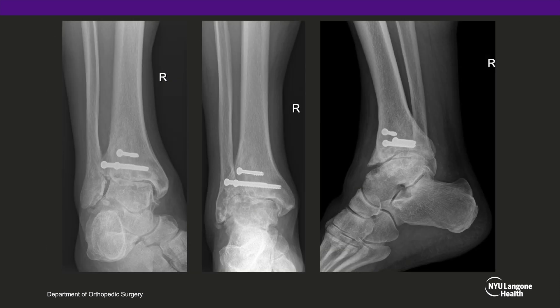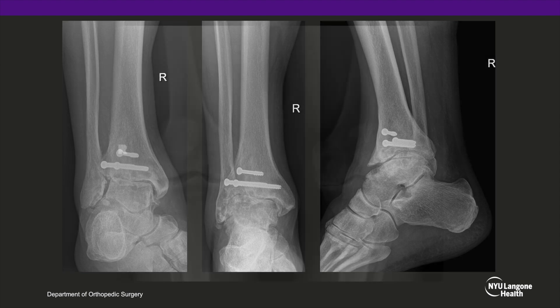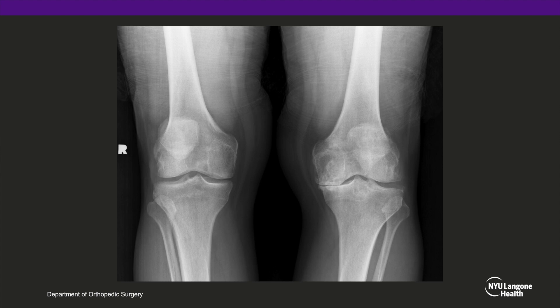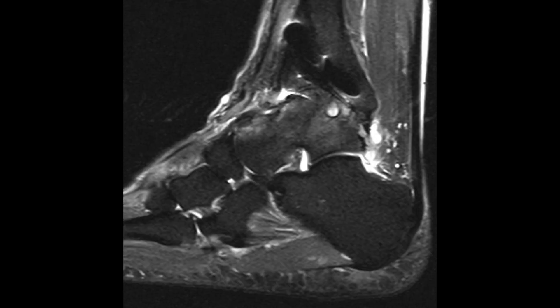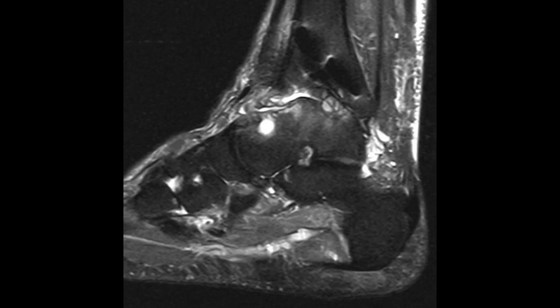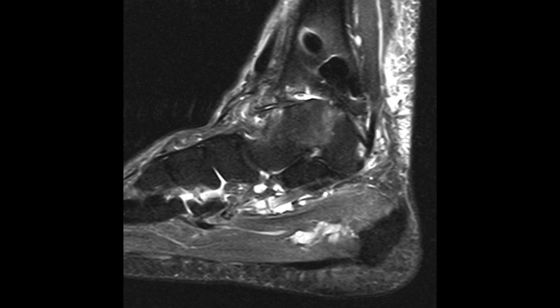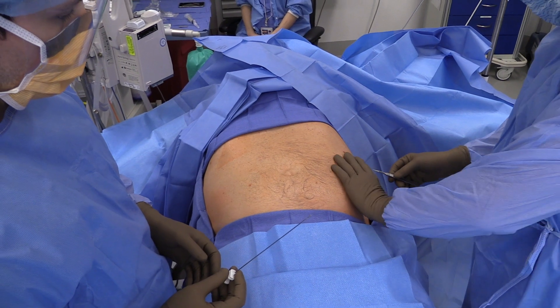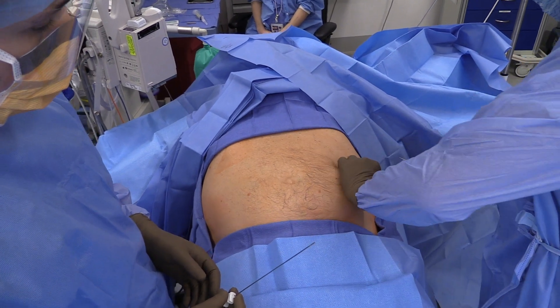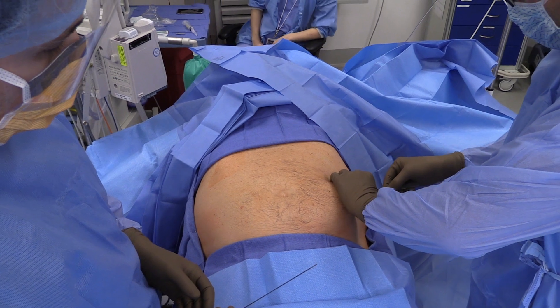X-rays confirm advanced tibiotalar arthritis, post-traumatic. Knee X-rays also confirm medial compartment OA. Ankle imaging in the sagittal plane confirms advanced tibiotalar arthrosis. The patient is placed supine and after appropriate prepping and draping, the procedure begins.